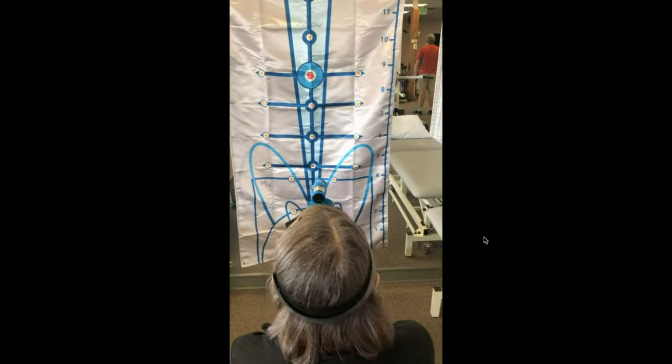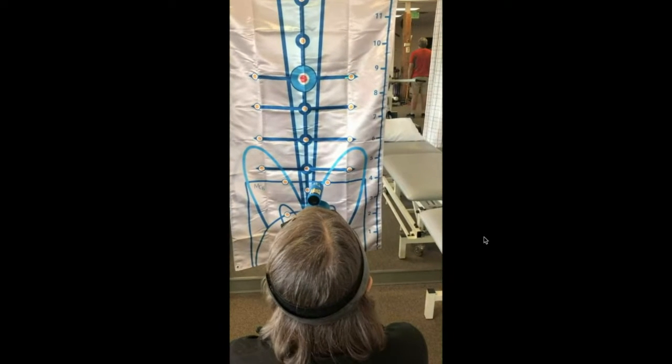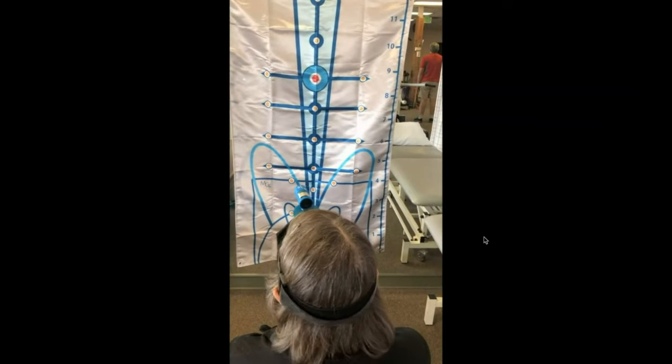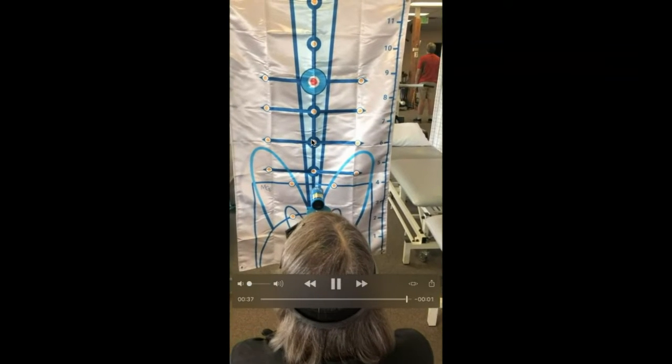It's really easy to go to the left side. It's much harder to go to the right side. But it gives her a quantification of how far she needs to go in order to have equal motion of her VOR right versus left while still having a center gaze. And once again, her center gaze is down and through this area of the second orange target.